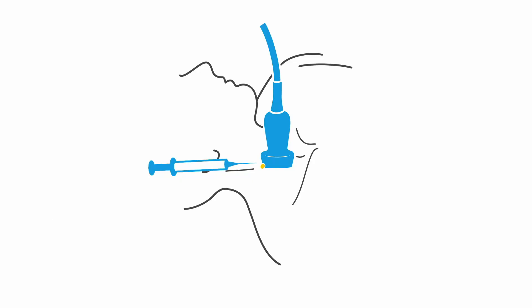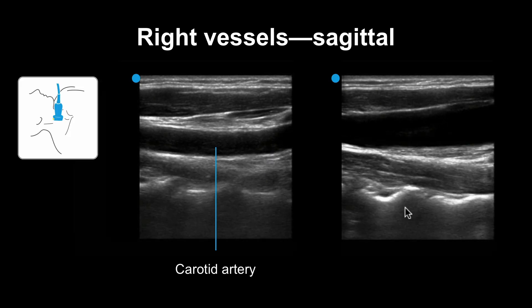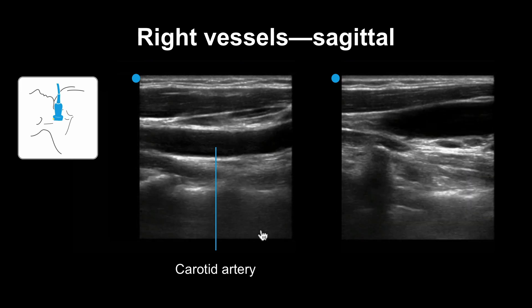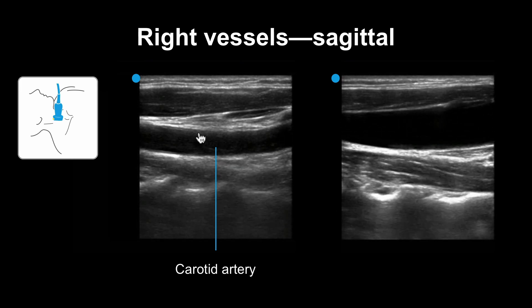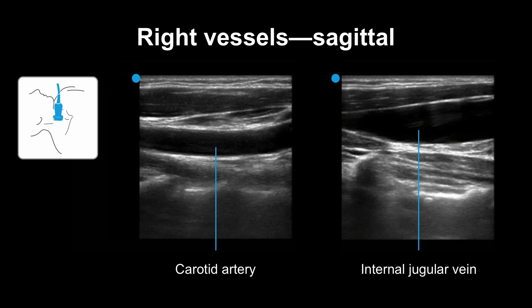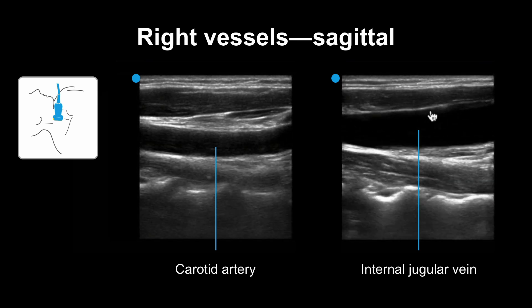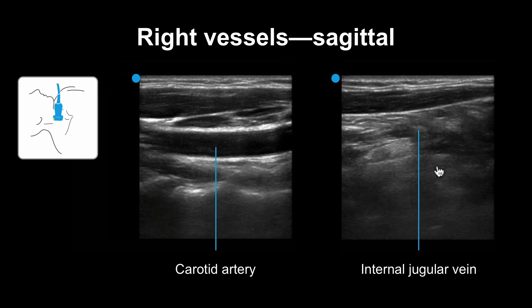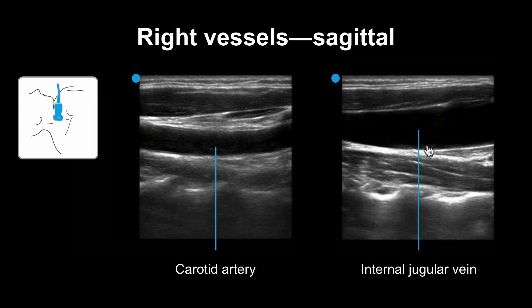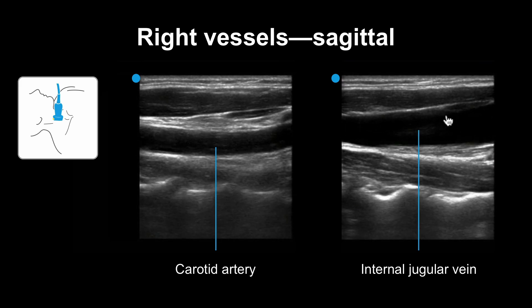Now let's take a look at the internal jugular vein and carotid in longitudinal or sagittal axis, when the vessels will appear like tubes. Here is a view of the carotid artery — you can see it looks like a long tube with pulsations and a thick wall. Here is the internal jugular vein; the wall is fairly thin and it picks up some pulsations from the carotid at the bottom, but for the most part it's not pulsating at the top.